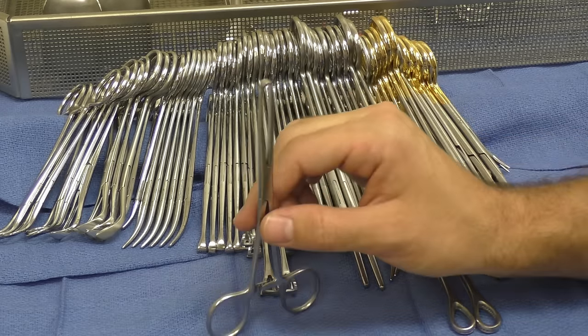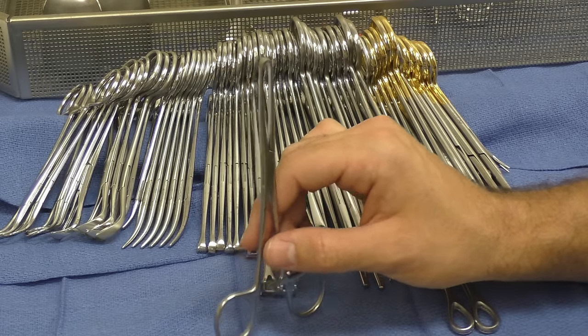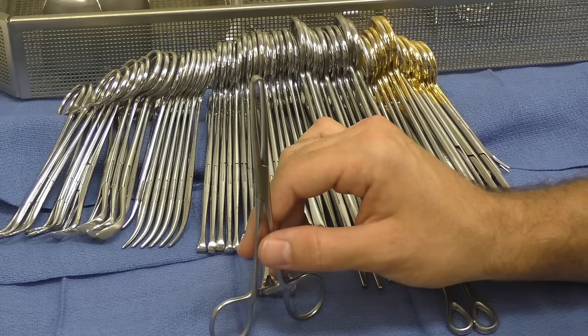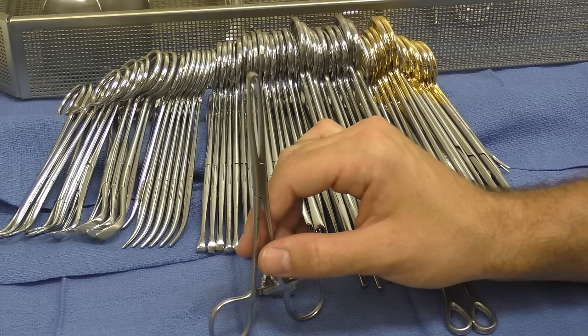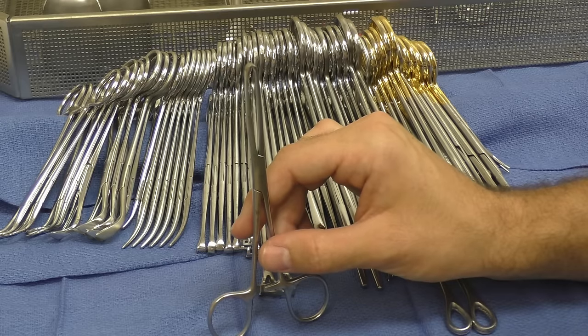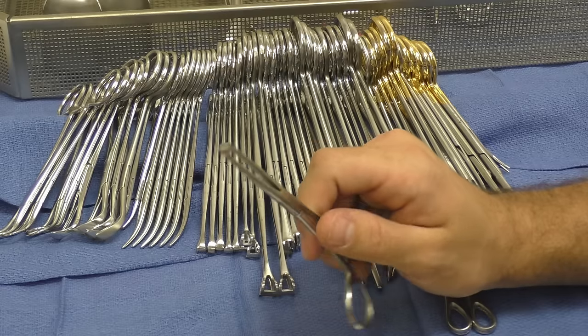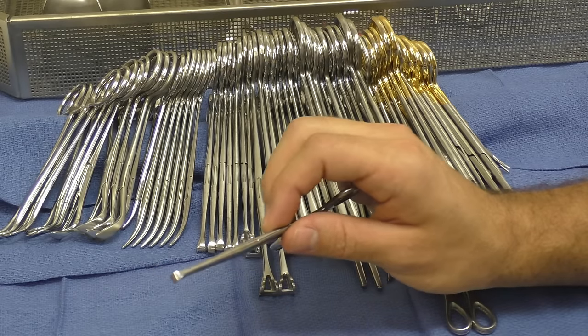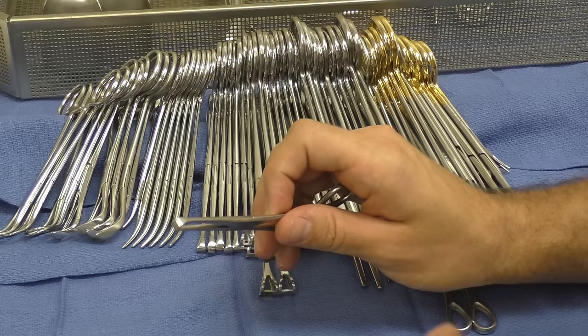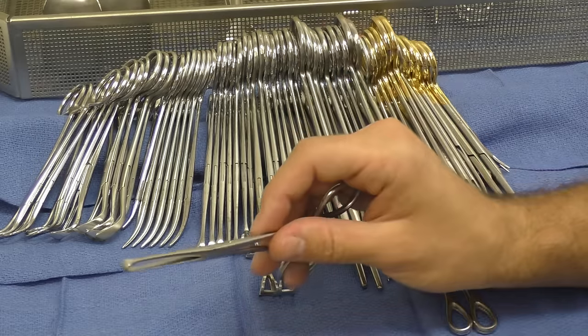These are a general purpose clamp for basically holding on to masses and tissue that you're trying to excise from a wound or from a patient. It could be a breast lumpectomy, it could be a lipoma, but the most important role of this is that it's atraumatic. It's not going to just tear into that tissue like some other clamps can.